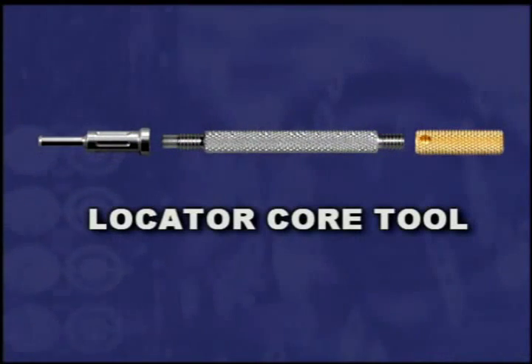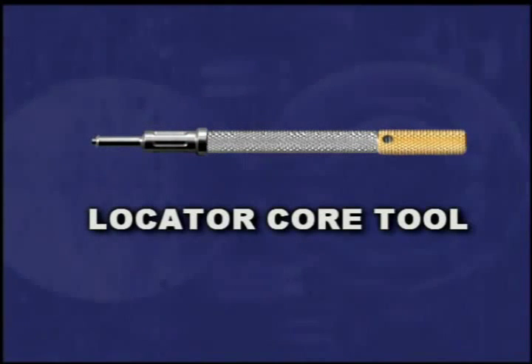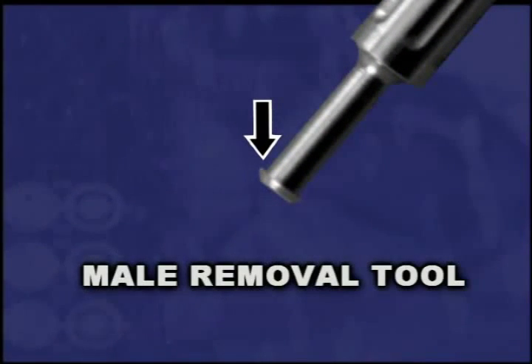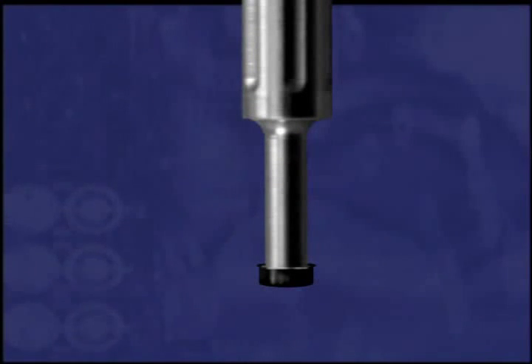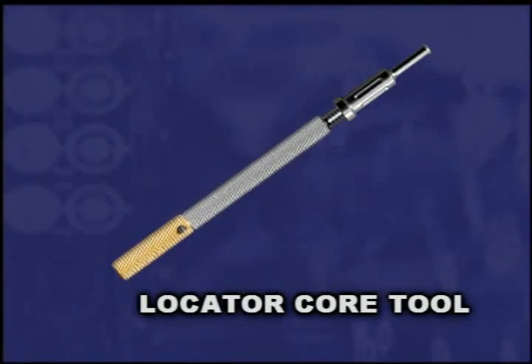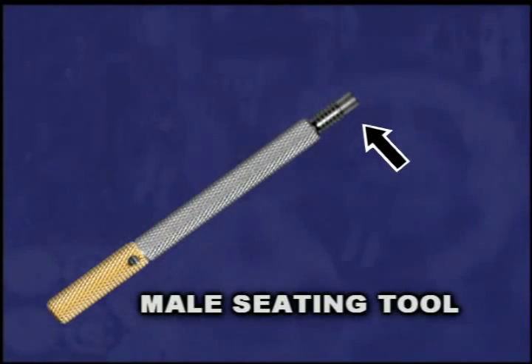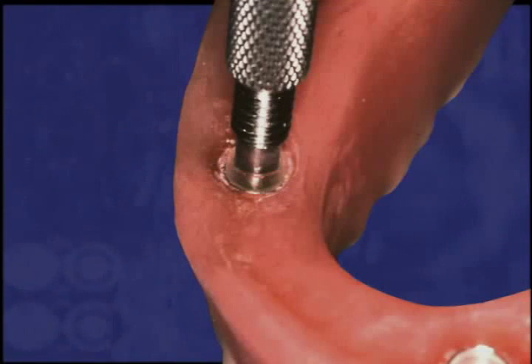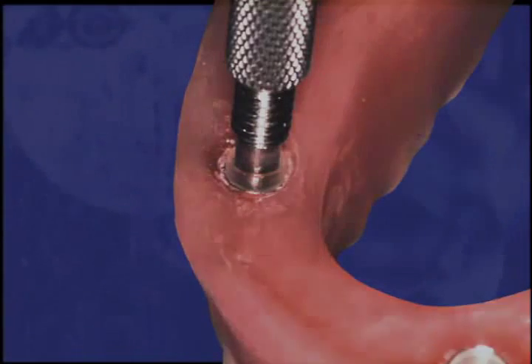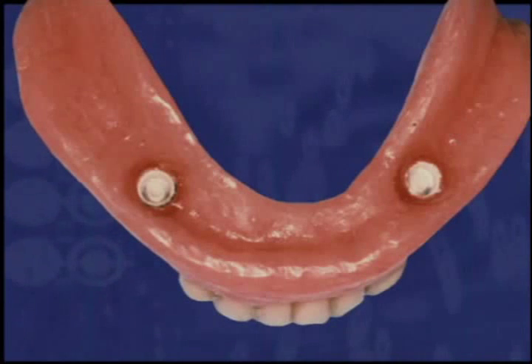The locator core tool contains three tools in one. Start with the fully assembled tool to replace the black processing males with the final nylon male. The male removal tool portion has a sharp circular edge; push it into the black plastic male and it will catch the sides and pull it straight up and out of the metal housing. Remove the male removal tool section to access the male seating tool portion. Place a nylon locator replacement male onto the end of the male seating tool and firmly push the final nylon liner into the metal denture cap. The overdenture was then ready for delivery to the patient and final adjustments.